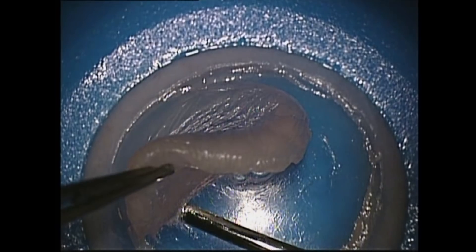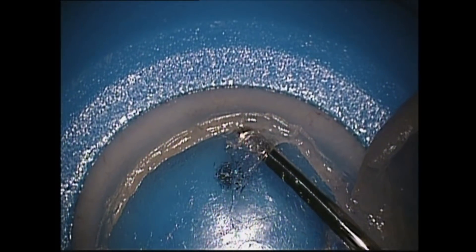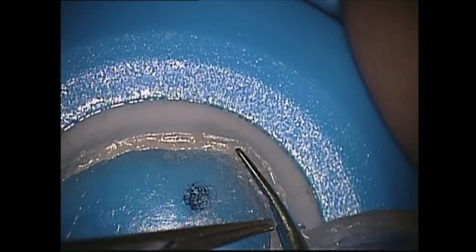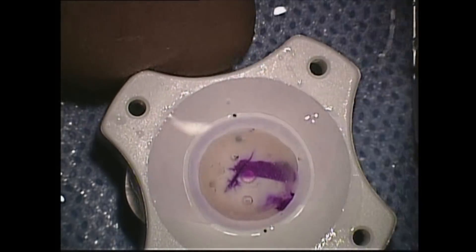Here we see a view of the cornea. The front tissue of the cornea is carefully and gently dissected away. This occurs across the entire cornea. Once this dissection is complete, this front tissue is cut away with scissors, leaving only the back cellular layer. The cornea is then turned over and punched with a round punch to deliver a round donor tissue button.